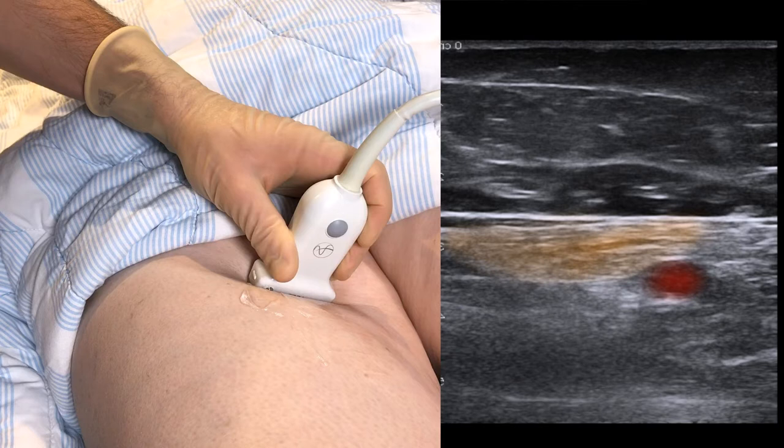The saphenous nerve is usually located in the area medial to the artery, here marked in green, but there are anatomical variations.